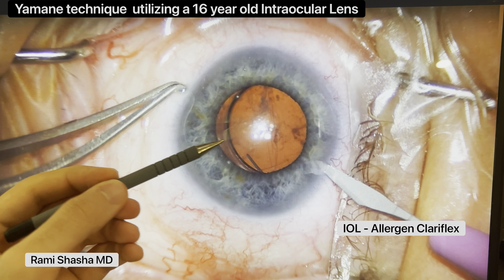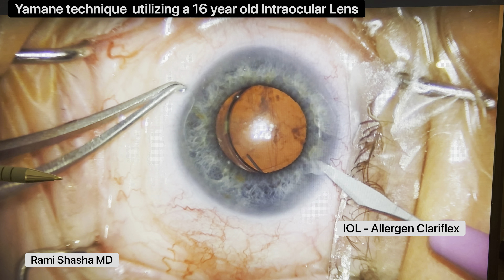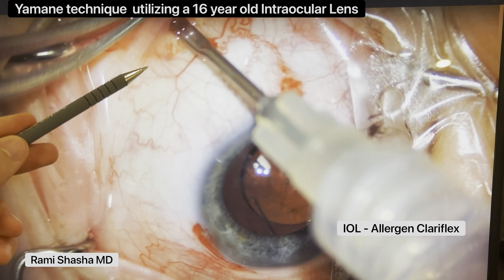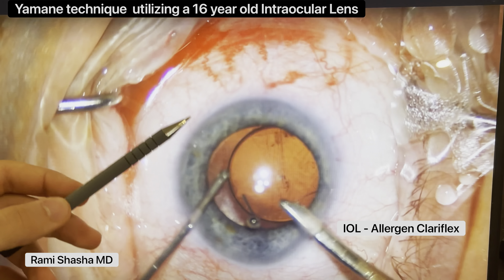This patient was referred for a dislocated lens and significant amount of prolapsed vitreous. I'm going to start off by creating two paracentesis incisions. I'll also perform a sub-tenon block, which I perform for all scleral fixated IOLs.